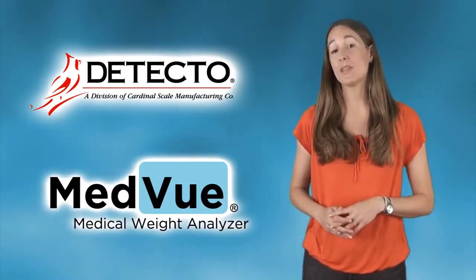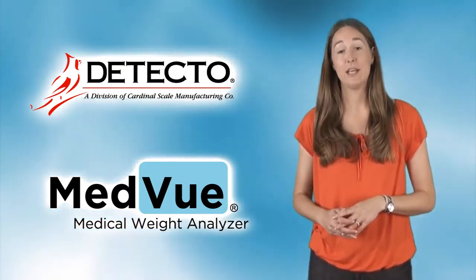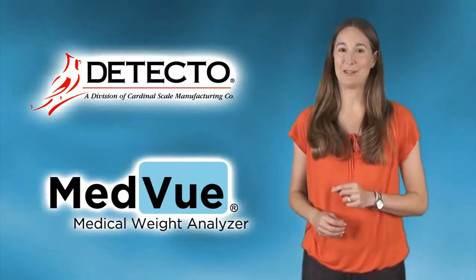The MedVue ships with a kit containing all the parts necessary for attaching the new bracket. Depending on the age and model you are upgrading from, you will need a screwdriver or an Allen wrench.